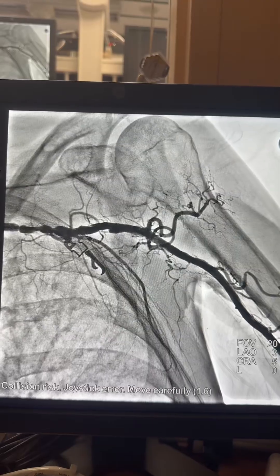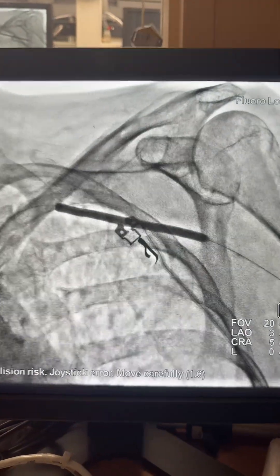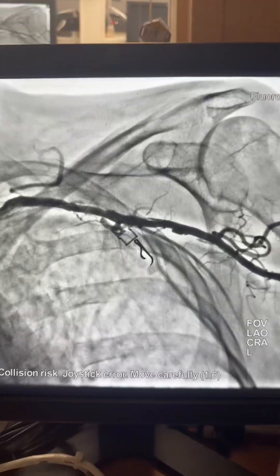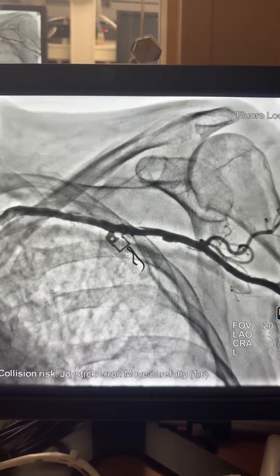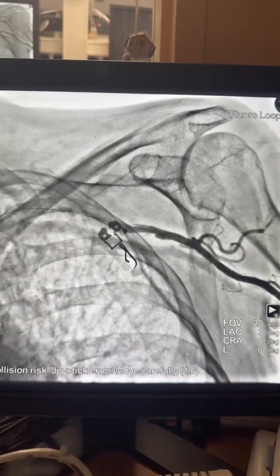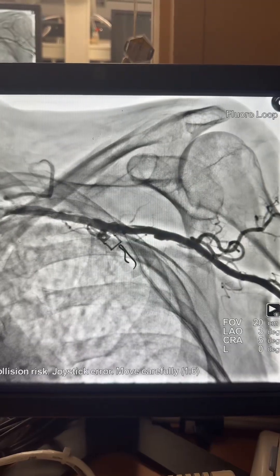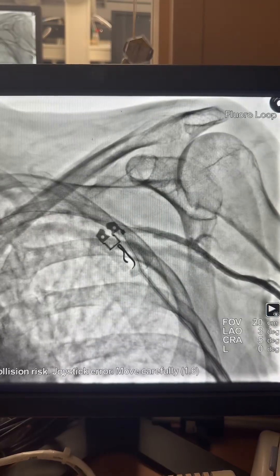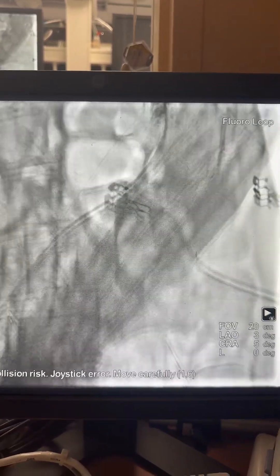I treated the subclavian lesion the same way — shockwave followed by the Ranger balloon. Here is the angiogram after: we have nice flow, non-flow-limiting dissection, and the gradient is back to less than 10 mmHg. We can feel the pulse in the left arm, and we can see the flow toward the radial artery — we can now get arterial line access.